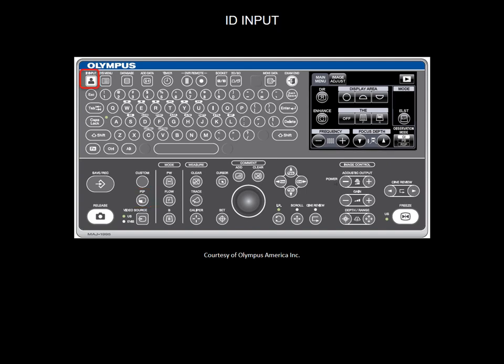The ID input button will allow you to create a unique patient's record. The system menu allows you to set up the display of several features like hospital's name, date format, comments, and other features.